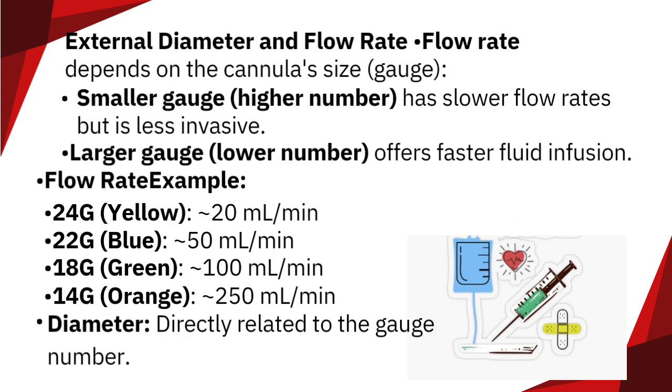External diameter and flow rate. Flow rate depends on the cannula size. Gauge: smaller gauge, higher number, has slower flow rates but is less invasive. Larger gauge, lower number, offers faster fluid infusion.